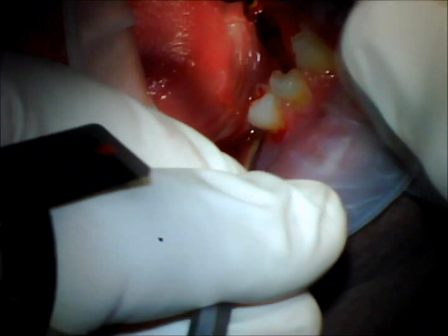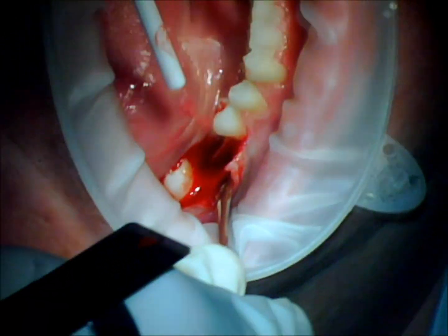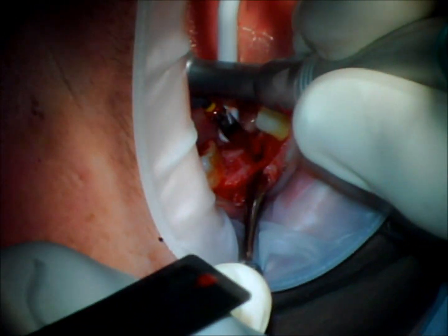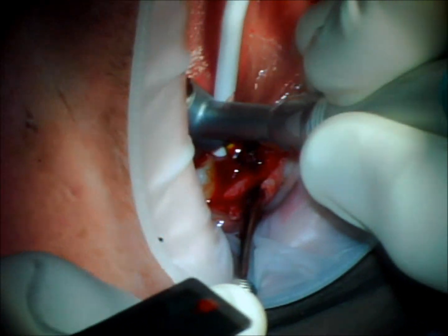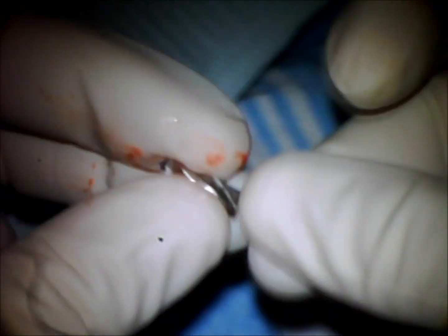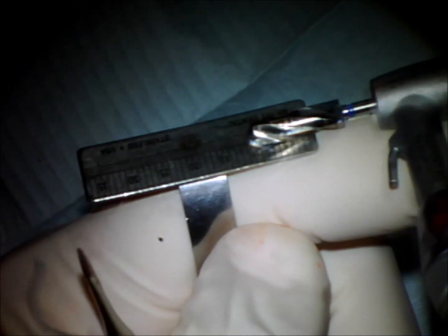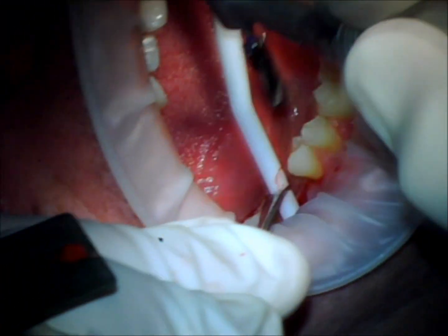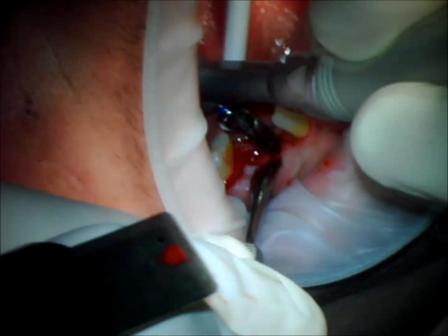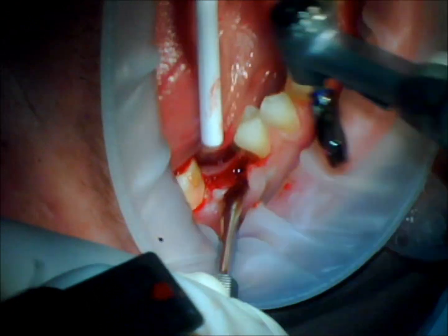Now, because I did anticipate that to be immature bone, I plan on putting in a 5x10 implant here, but because I anticipated it being pretty immature bone, I didn't use the full-size drill. The thinking was to use one size smaller so that if there were any problems with stability, we could just go ahead and compress the bone and get good primary stability. I don't want to go to the very bottom with this one, but I do want to profile just the very top here for a 5mm implant — I just did that a little bit freehand.